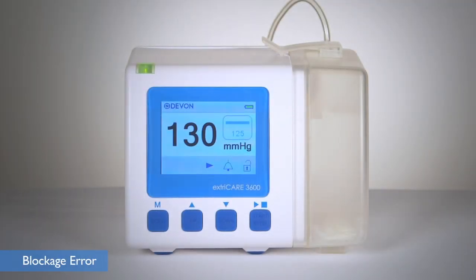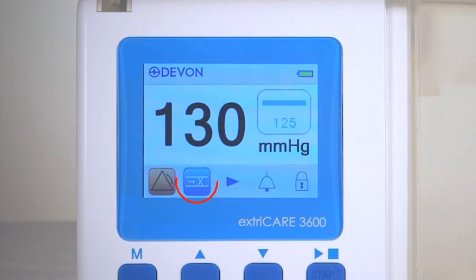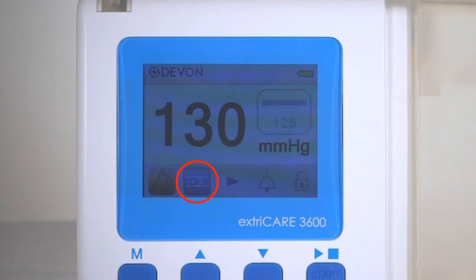If there is a blockage in the tubing or the dressing, the alarm will sound, the yellow LED will flash, and the blockage error symbol will appear on screen. The pump will continue to run. Replace with a new dressing and tubing set to remove the blockage.